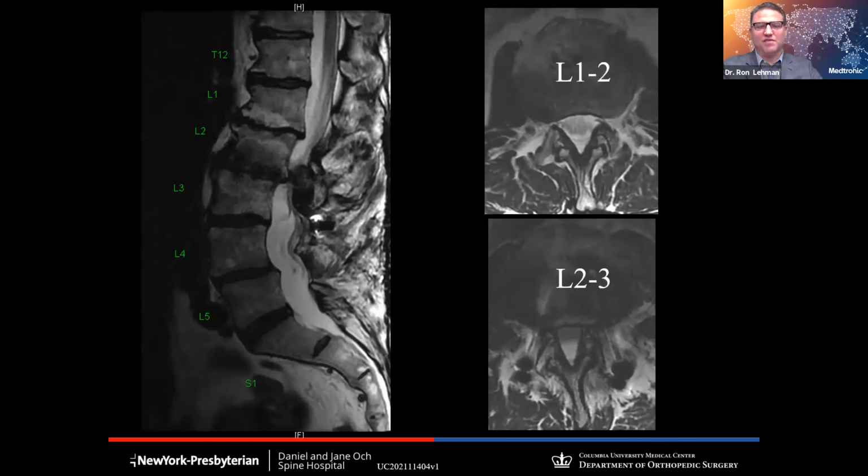And when we look at the MRI, obviously we can see that L2-3 is the worst level, really has some pretty significant stenosis at that level and significant Modic endplate changes at L1-2. So in this case, I'm planning on L1-2 down to the pelvis. And initially, my plan was just as Neil would do, is do an L5-S1 OLIF through the bifurcation and do an L2-3 OLIF and maybe L1-2, although I often have trouble getting to L1-2 as well because the rib cage gets in my way. I'm not quite as slick as Neil at getting up that high sometimes.